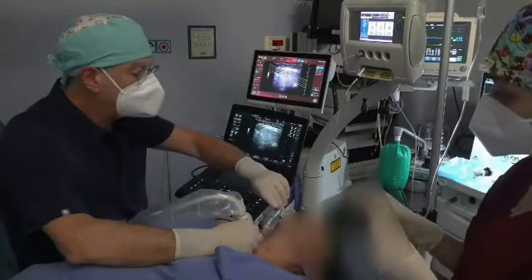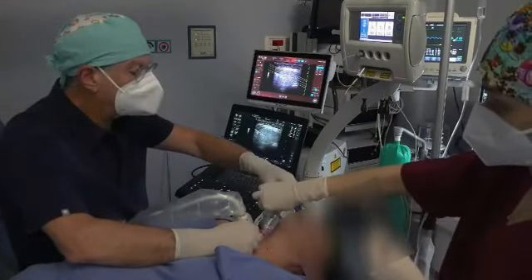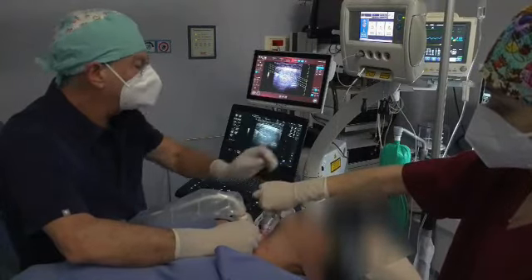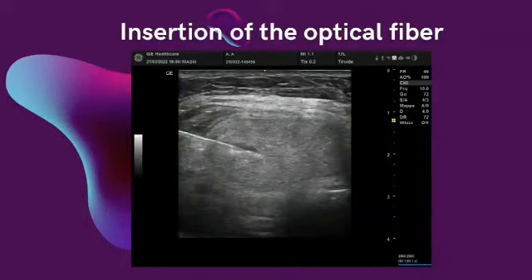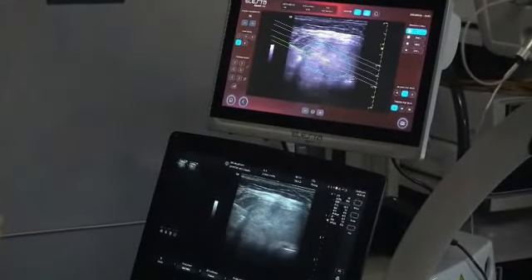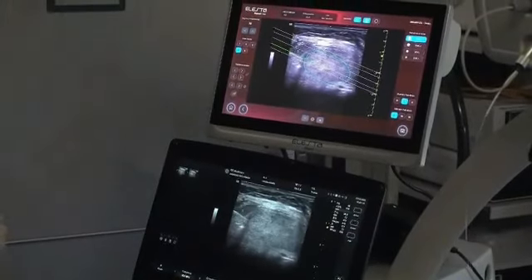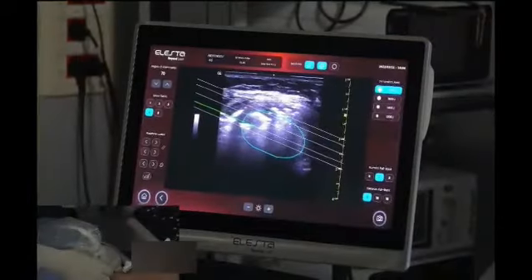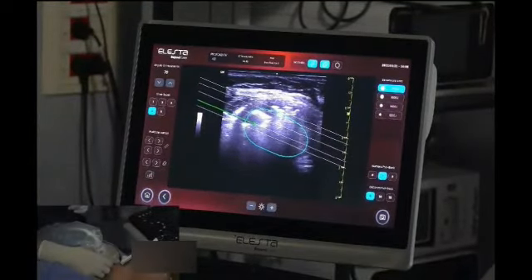The patient must put on protective glasses. The optical fibre is inserted through the guide needle into the target nodule. We insert the guide needle on the 3rd line as per programming. The guide needle appears hyperechoic. The active fibre produces a hyperechoic area. The necrosis appears hyperechoic due to the micro bubbles created by the evaporation of liquids.